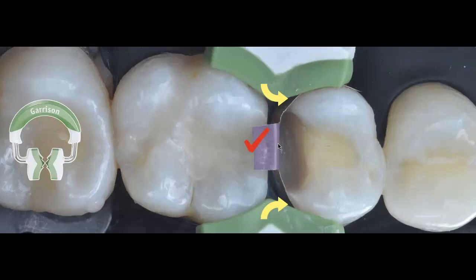form. Now, I have to make sure, and this is the reason why I separated these two restorations, that when I go ahead and restore tooth number 14, I select the band that creates enough pressure between these teeth to allow for a little bit of separation, allowing me to reestablish a really good interproximal contact.